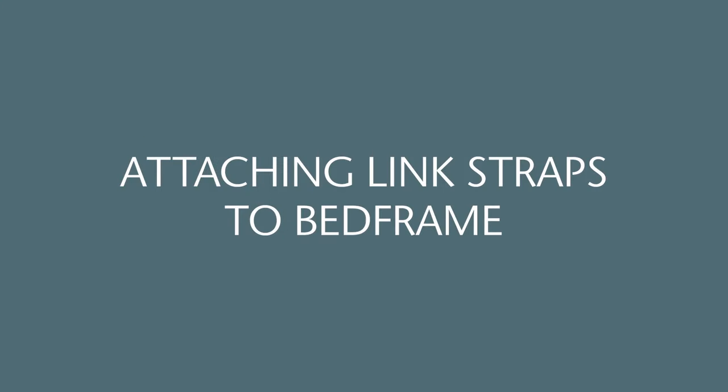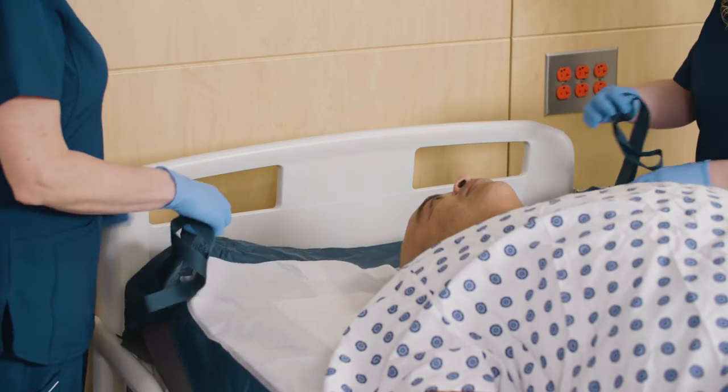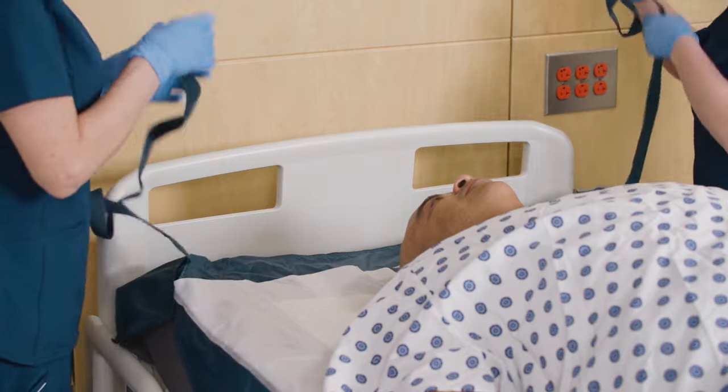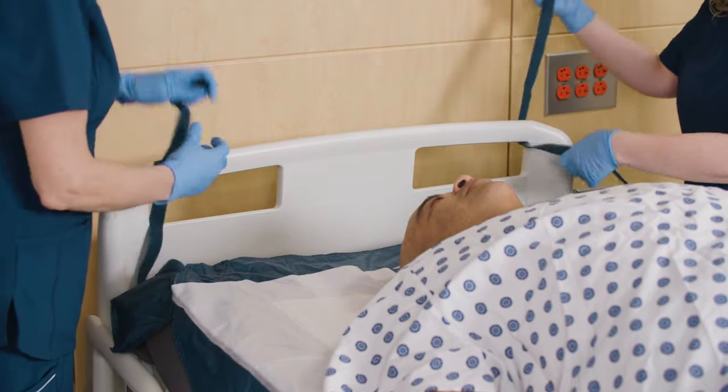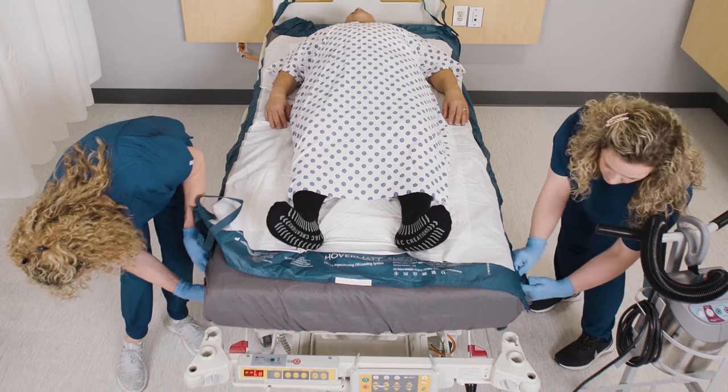Attaching link straps to bed frame. Remove corner Velcro connecting straps from pockets and loosely attach to solid points on the bed frame or headboard to reduce mat migration. Repeat the process on the other three corners of the mat.